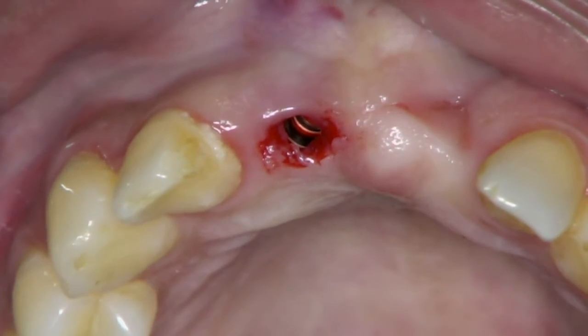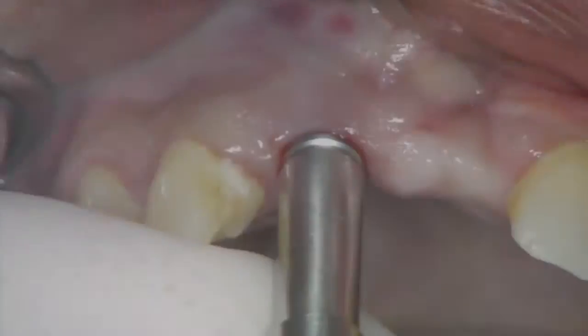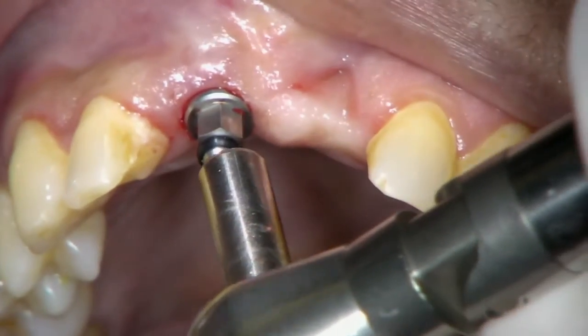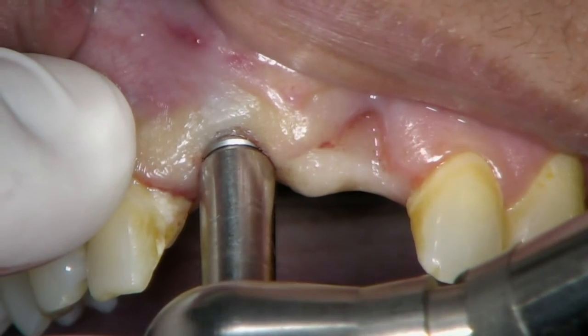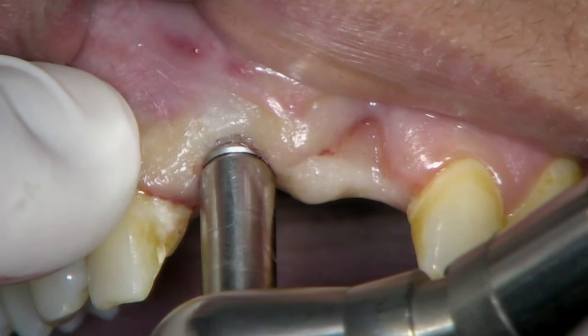For this, I first place a special reverse torque screw in the implant body and then tighten it in reverse. Then, using a high reverse torque wrench, I place a gentle and consistent load of less than 250 Newton centimeters on the implant.